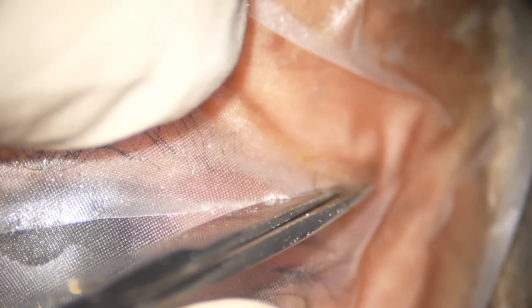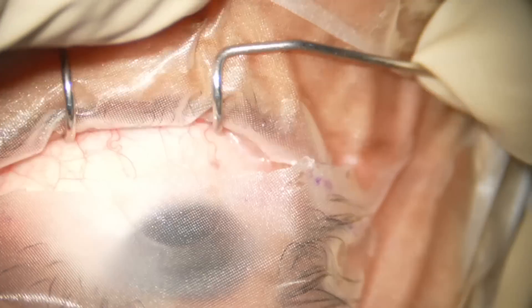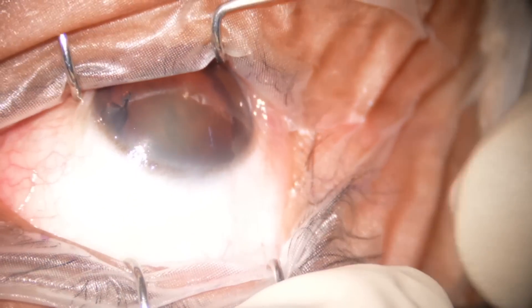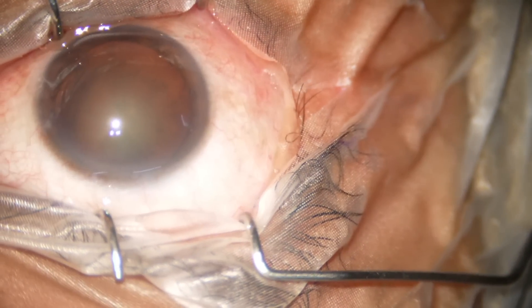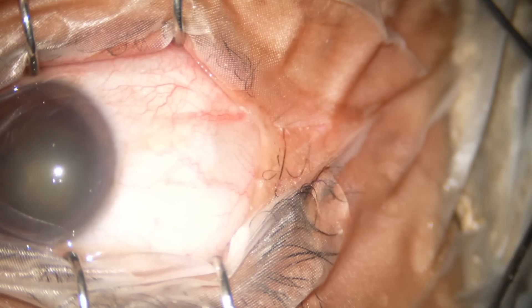Now I cut the drape at the middle. The speculum is applied, with drape positioned in such a way that the eyelid margin is nicely covered. There are two eyelashes here — I am just trimming these two eyelashes.